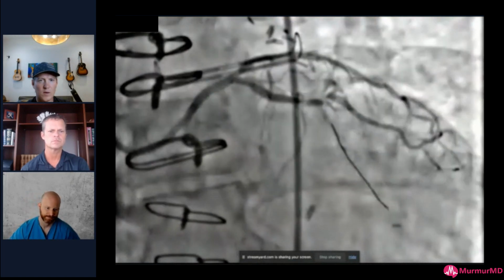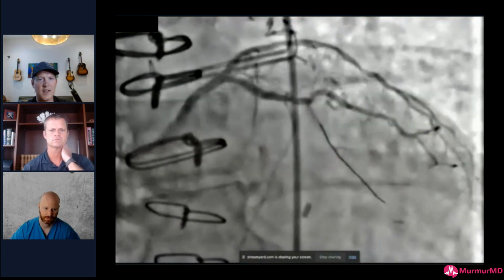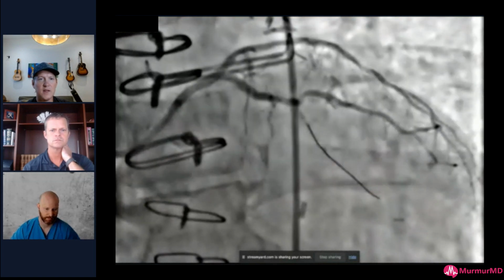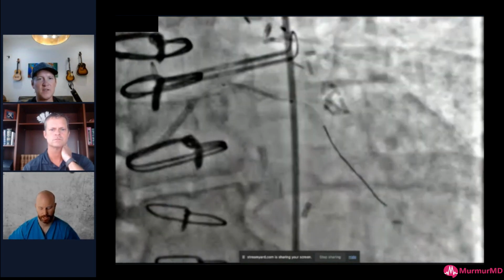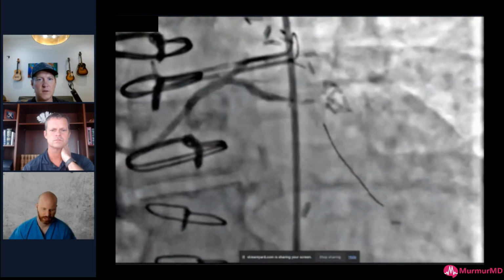I think it's also important to note that when you're pulling the shockwave balloon back, it almost always sucks the guide in. So just be cognizant of that, so you don't dissect the left main, because you're inherently in calcified vessels and you're going to have a lot of friction on the balloon. So I always try to pull my guide back a little bit, or at least be cognizant of where my guide tip is. I think it's a really good point.